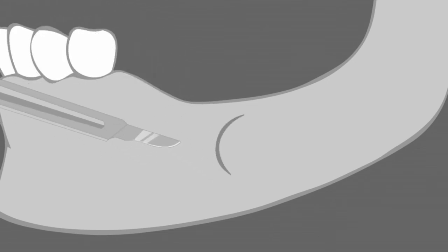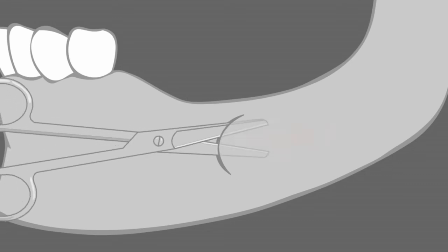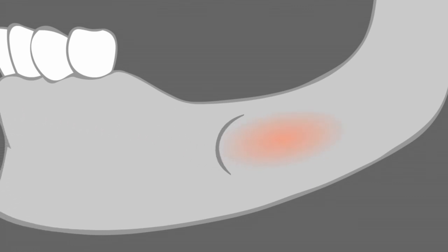Incision and preparation of a tunnel flap. The preparation is controlled with a surgical template. Insertion of the expander and fixation with a bone fixation screw at the flap of the expander. Two-layered wound closure. The first suture enables a wound closure without tension.